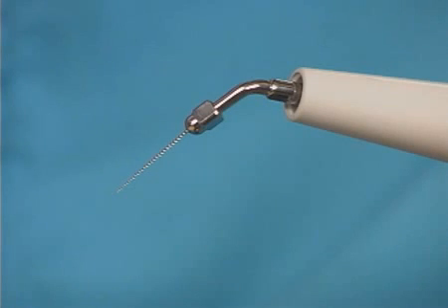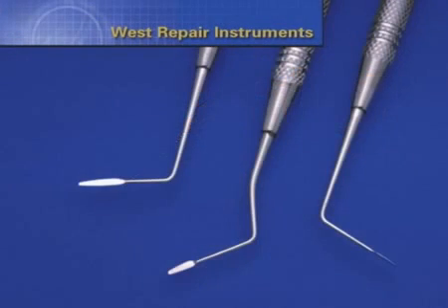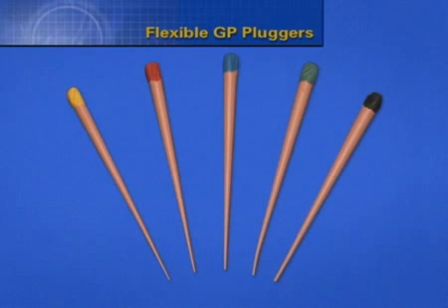the periapical tissues. The West repair instruments can also be used to carry, place, and adapt MTA. These carrying devices provide thin, flexible trowels angled at different orientations. In the instance of canal curvature, MTA may also be gently tamped down around a curvature to the approximate length by using a customized, non-standardized gutta-percha cone as a flexible plugger. Flexible gutta-percha pluggers, in conjunction with ultrasonics, is yet another option and method to position MTA precisely.